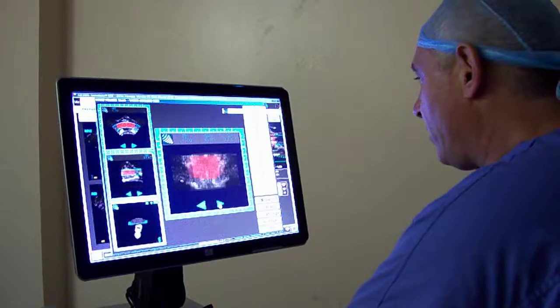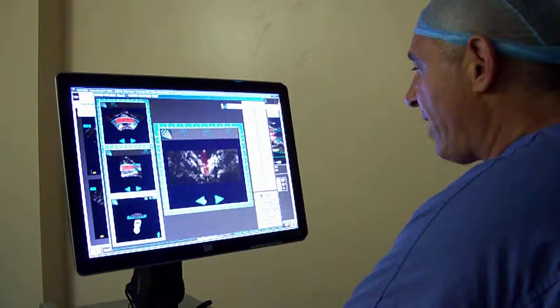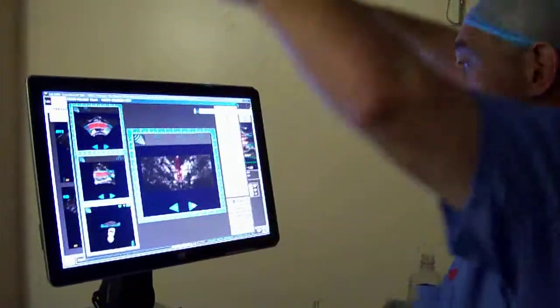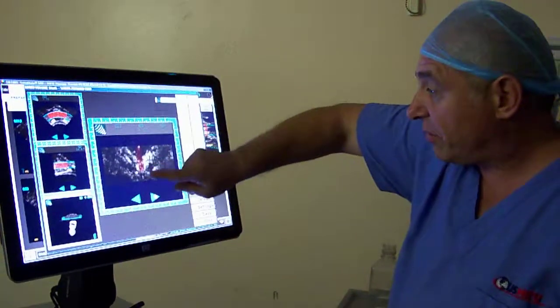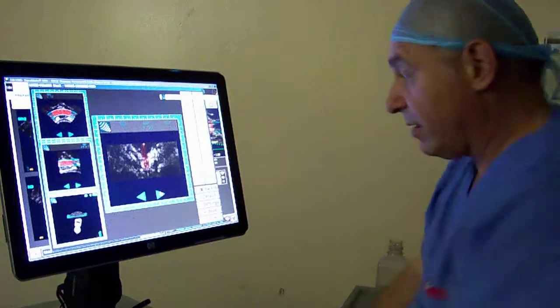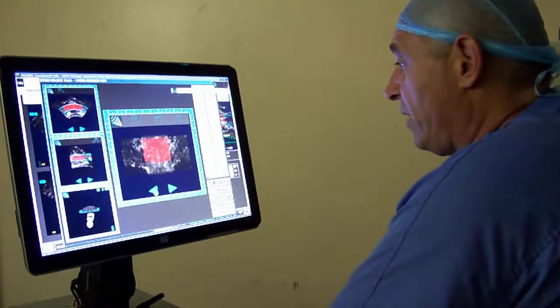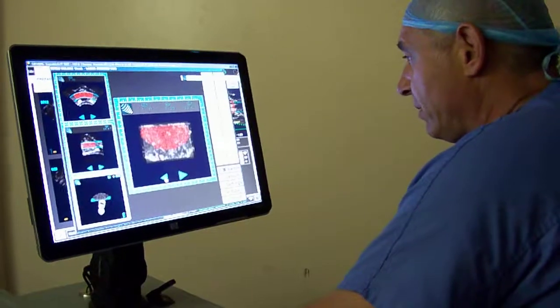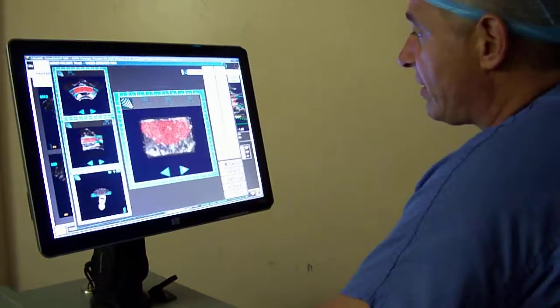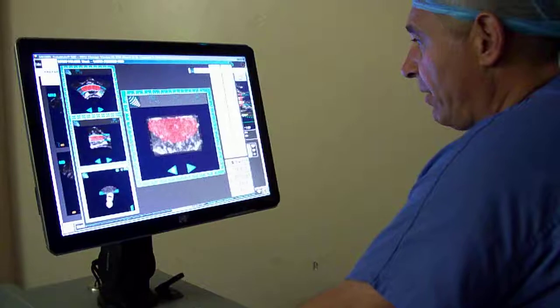And now we're going to look at this at different levels. This is very high, looking from the top of the prostate down, and you can start to see where the apex clearly is, this region right here. And you'll see that as I'm putting energy, I've got the whole prostate covered very nicely. In fact, you can see out laterally.